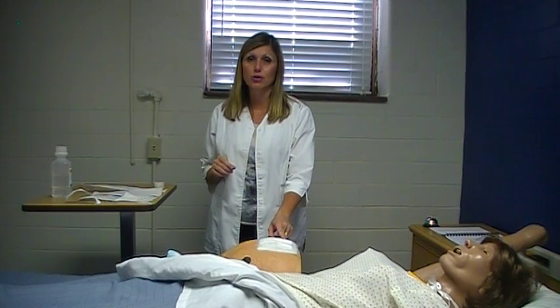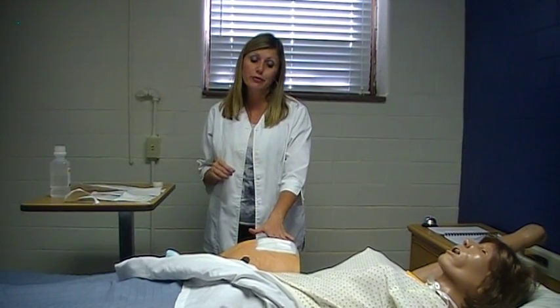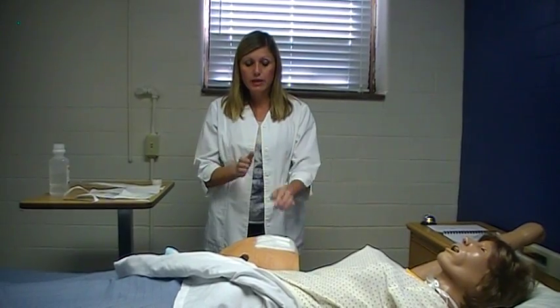If you were to think ahead of time before you even got sterile, you could actually go ahead and write date, time, initials on that ABD pad. Just be careful though, because you don't want to put the side that you've written on on the bottom side next to their skin, okay? I would advise using the piece of tape just like I did with the date, time, and initials on there.